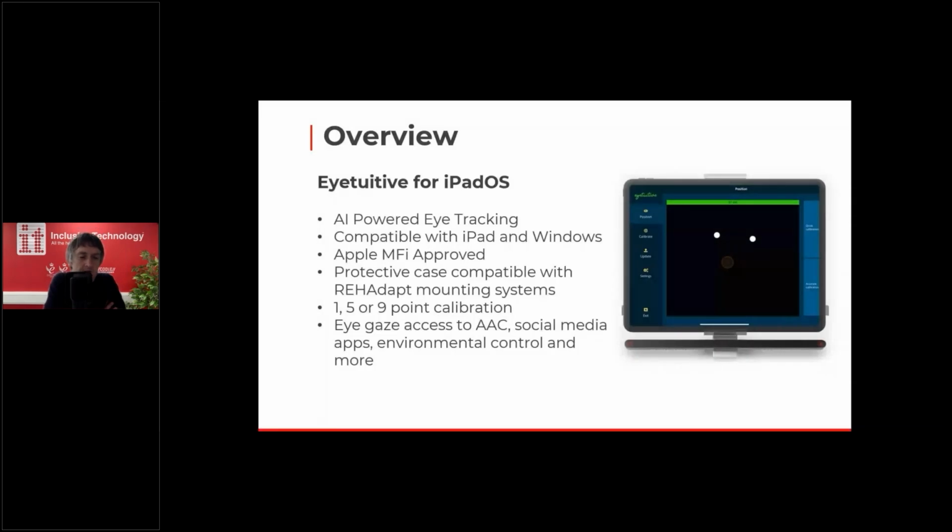Okay, so those are the brief case studies, just showing Eyetuitive in action. So onto the overview, just to reiterate the points that we've been through. The main three points about the eye tracker were the AI-powered eye tracking on Eyetuitive, compatible with iPad and Windows.